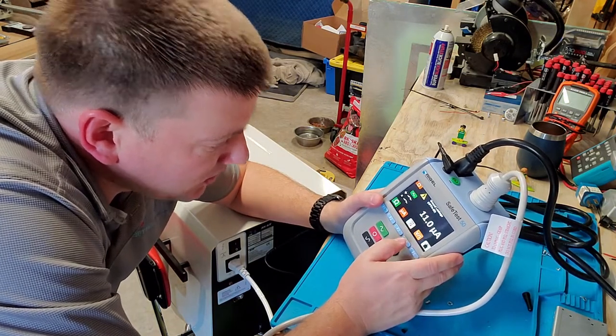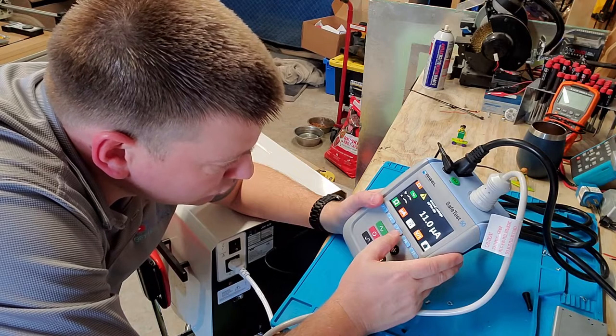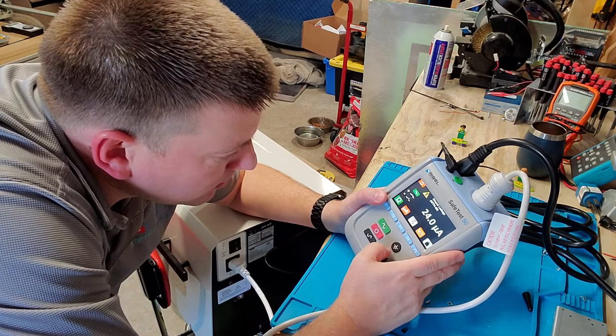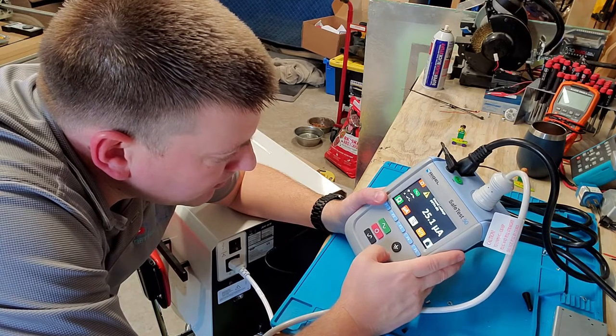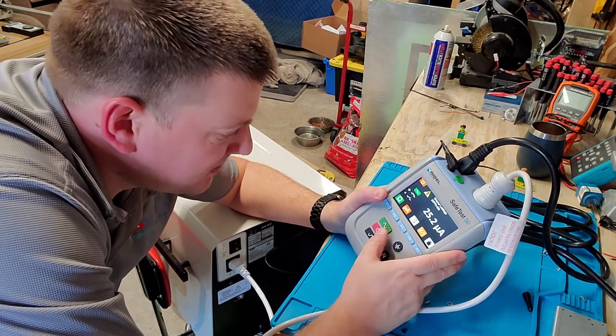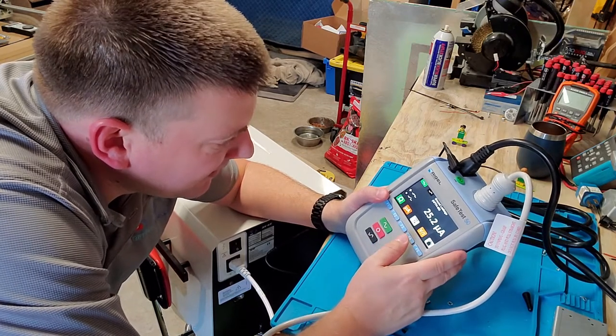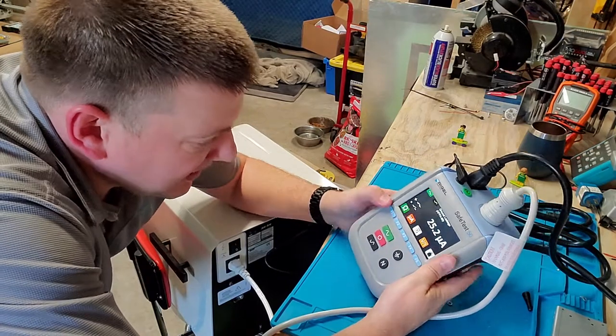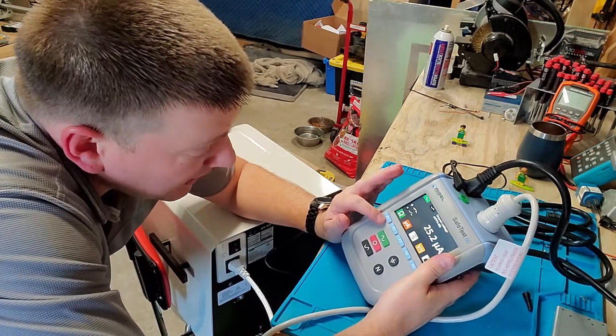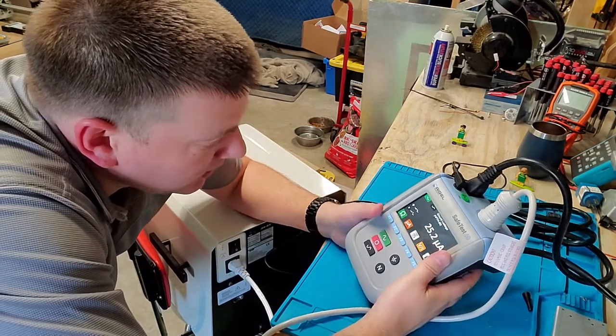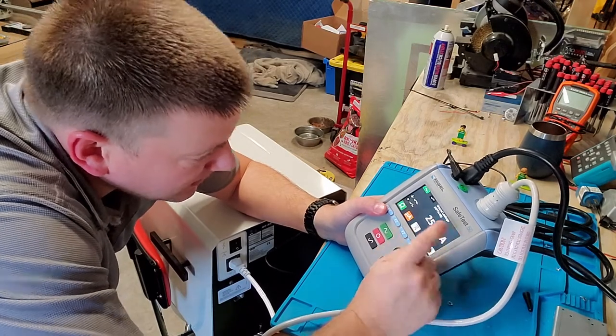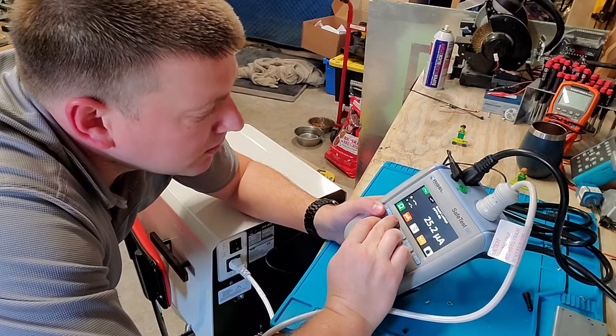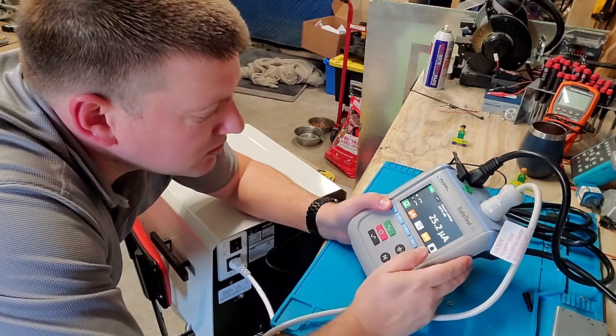The only time I would ever see this be different is if there is a fault condition someplace. Kind of a cool little menu, not necessary for an electrical safety but it's very cool that it's all laid out right there on one page. So I can go back to that menu, that's for chassis leakage. Now we can go to ground leakage. The only one in the United States for NFPA that's necessary is to first do your ground and then to do your chassis leakage.